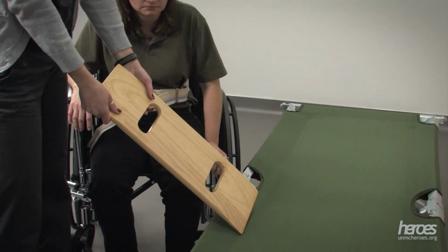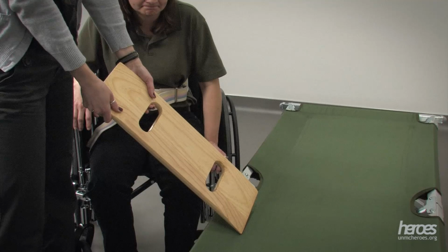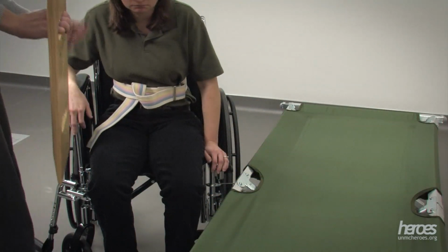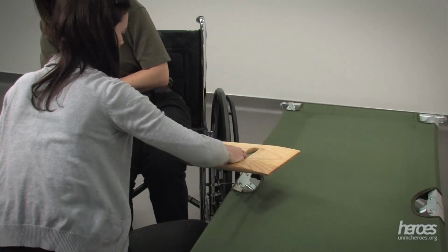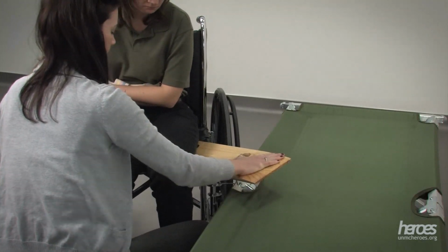To help transfer the individual, a slide board will be used. This device can be used when an individual has a hard time standing up. The slide board can help an individual move from one surface to another without having to stand up. Ask the individual to shift their weight onto their hip furthest from the cot. Position one end of the slide board under the individual's upper thighs and buttocks nearest to the cot. The other end of the slide board will rest on or near the cot.